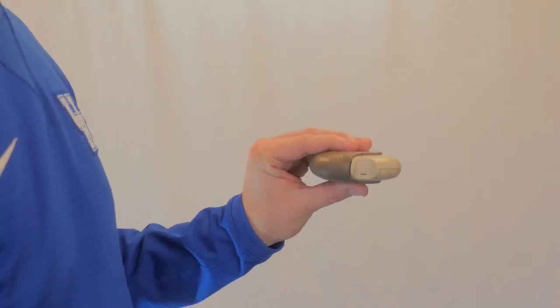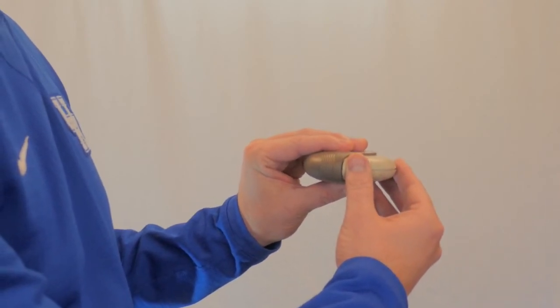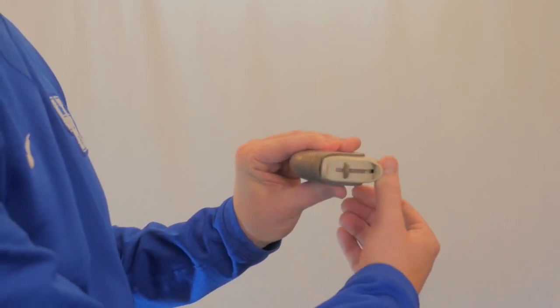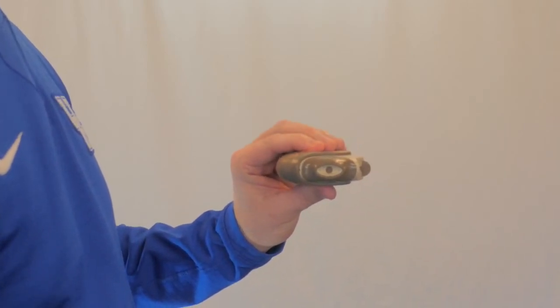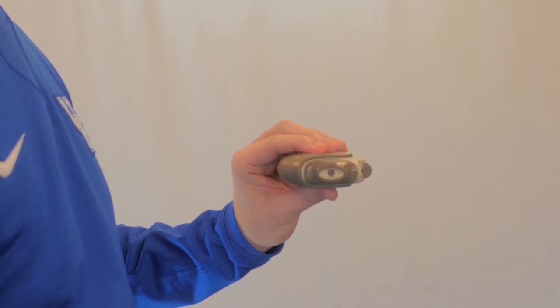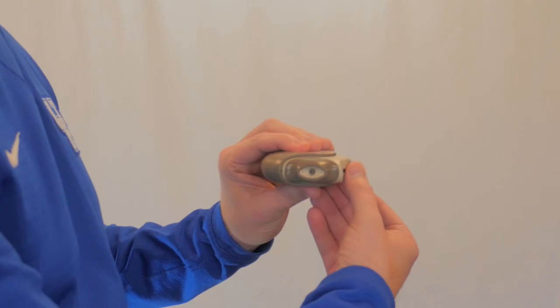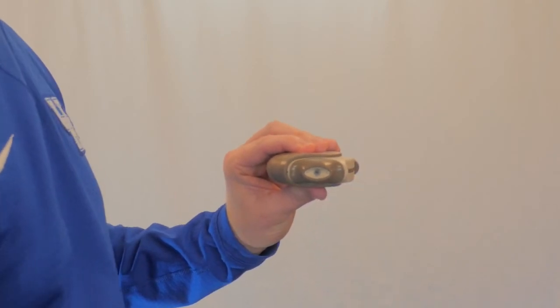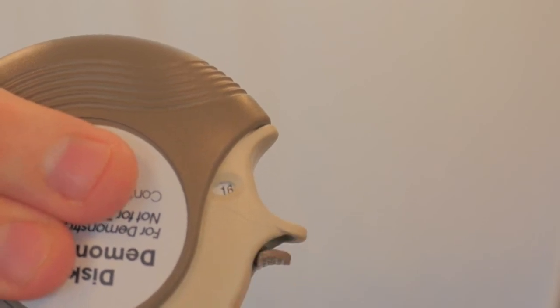Hold the discus in your left hand and place the thumb of your right hand on the thumb grip. Push the thumb grip away from you as far as it will go until the mouthpiece shows and snaps into place. Hold the discus in a level flat position with the mouthpiece towards you. Slide the lever away from the mouthpiece as far as it will go until it clicks. The number on the counter will count down by one. The discus is now ready to use.